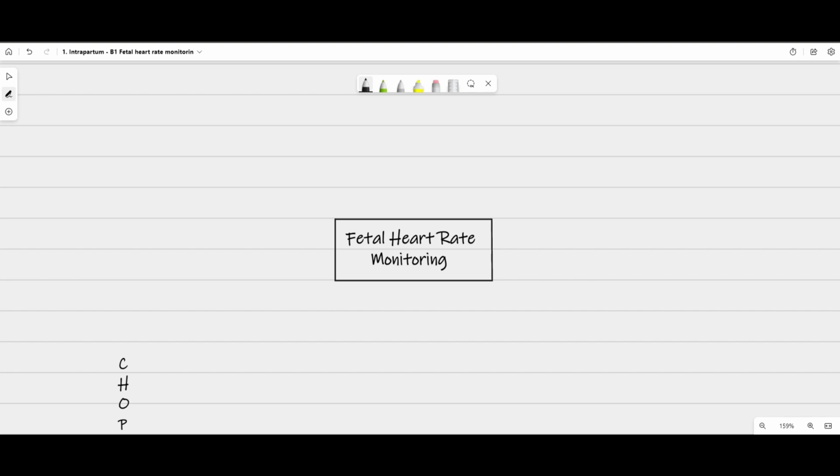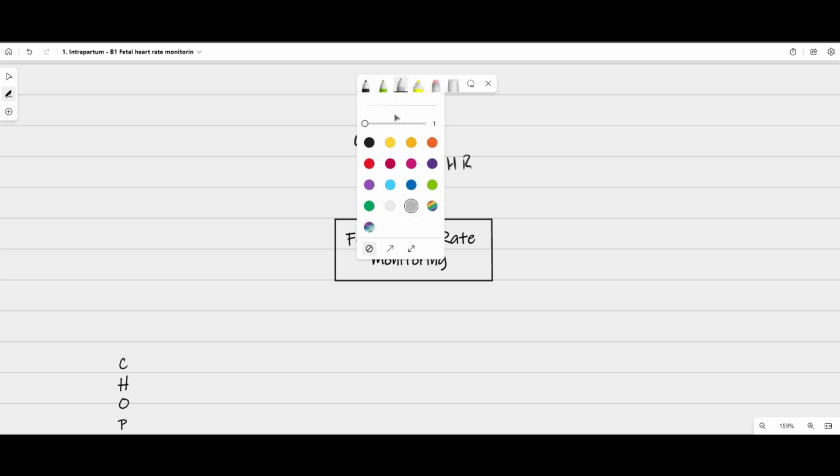Hello, in this video we're going to talk a little bit about fetal heart rate monitoring. So what is fetal heart rate monitoring? We're looking at what's going on between contractions and the fetal heart rate, and we are looking for the relationship between the two.